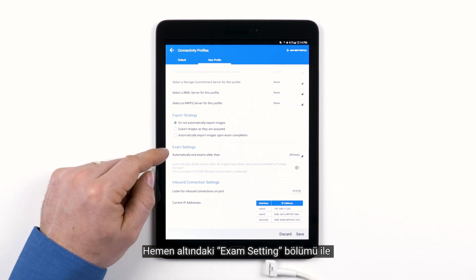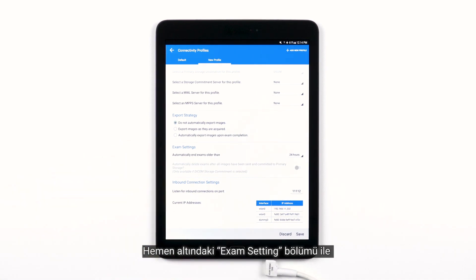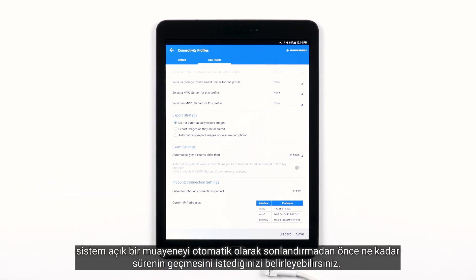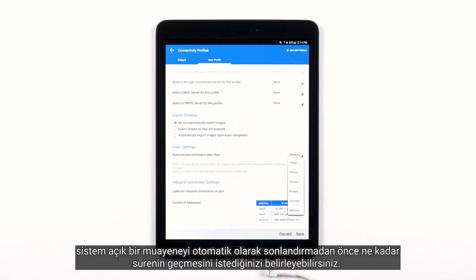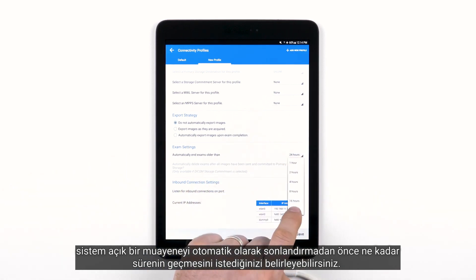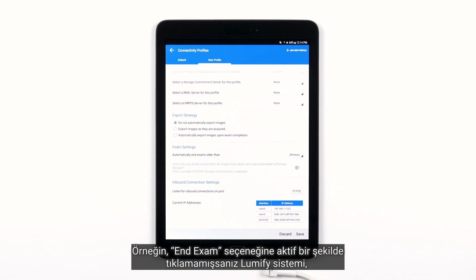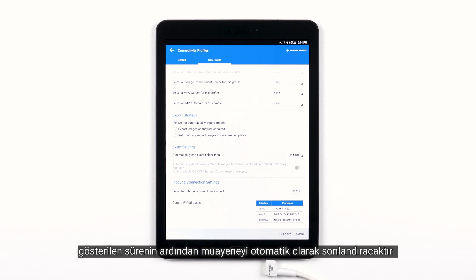The exam settings section just below allows you to set the amount of time you want to pass before the system automatically ends an open exam. For instance, if you haven't actively tapped the end exam option, the Lumify system will automatically end the exam after the amount of time shown.